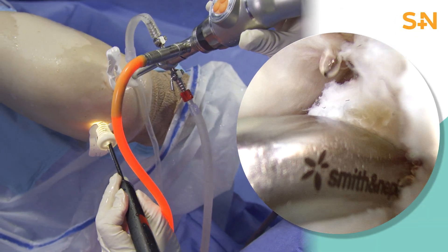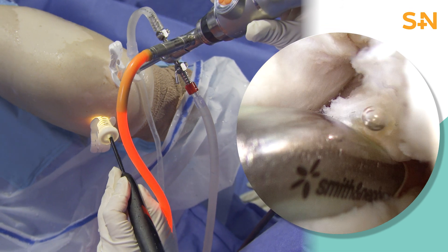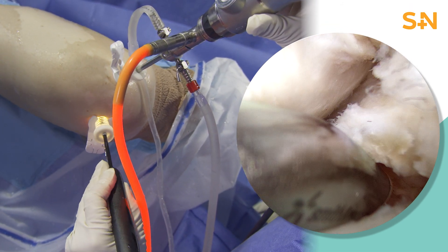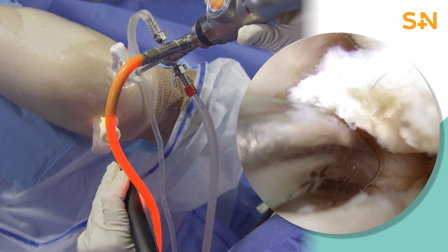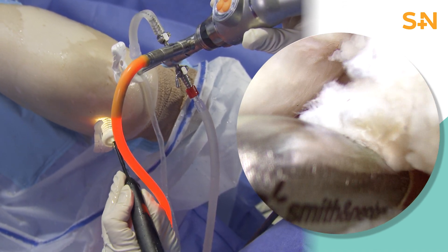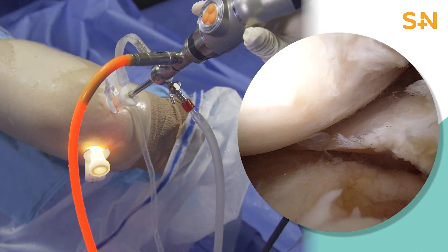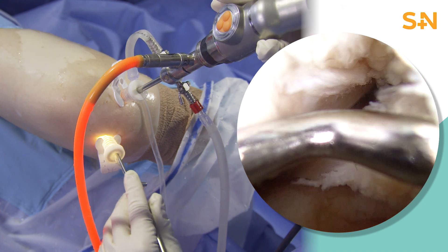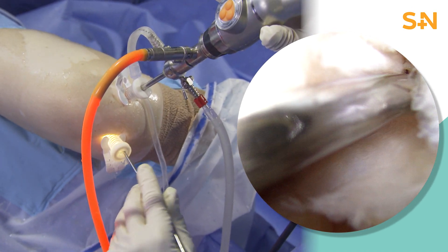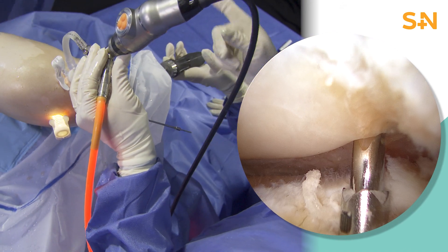In this case, there's a lateral meniscus root tear. Oftentimes, there are attachments between the lateral meniscus and either the PCL or the femoral condyles, so it's essential to fully evaluate that posterior root attachment of the lateral meniscus. In this case, there's a fair amount of instability of that lateral meniscus; however, in some cases, there's actually very little instability. We've identified the root attachment site for this lateral meniscus and are ensuring that there's appropriate excursion on that meniscus in order to be able to repair this back to the site.